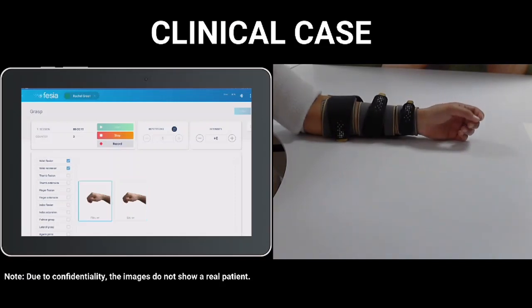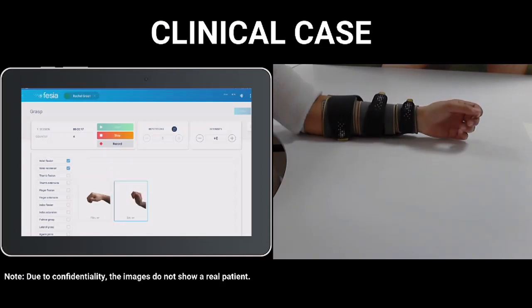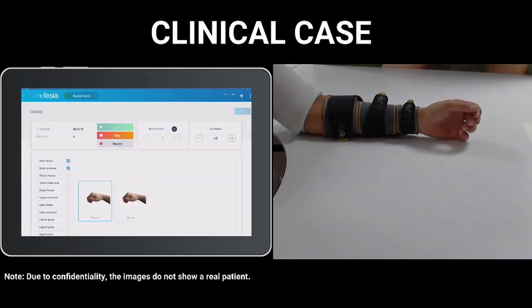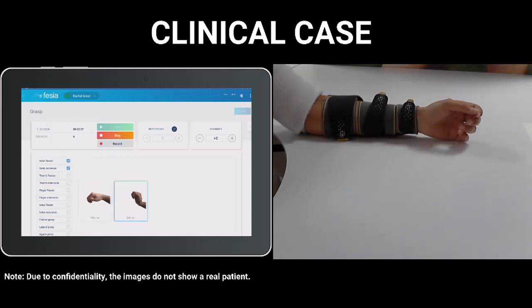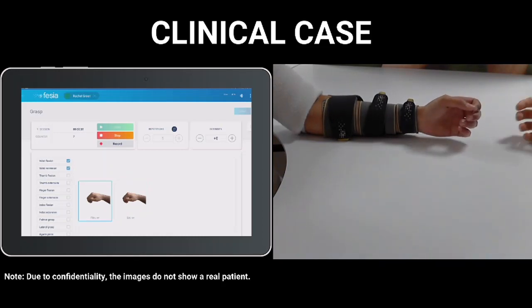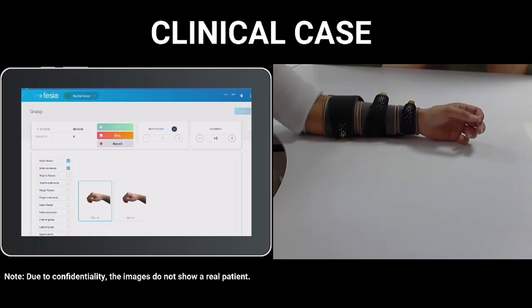As Rachel is a common patient in Fesia Clinic, all the movements are already configured, and it is not necessary to configure them each day. And the session can be started very, very fast. Okay, now we are going to start doing the same movement, okay? But I want you to help a little bit, both the flexion and the extension, okay? Let's start now.